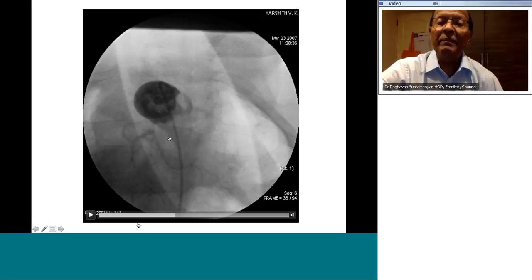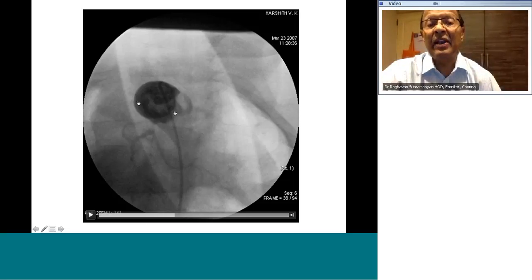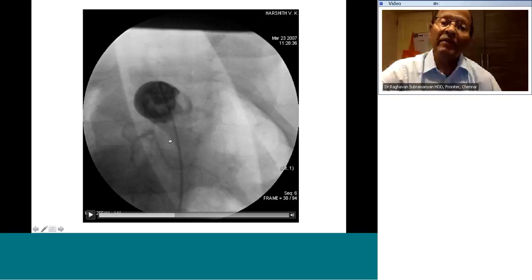Therefore, if you want to separate them and look at the aortic valve end on, this is the best view. You are looking into the aortic valve orifice, and you will be able to see the anterior and posterior sinuses, the right-sided and left-sided relationship as well as the anteroposterior relationship. Now, this view is very useful for seeing the proximal coronary artery origin in complex anomalies. I am not going into the details, but how do you identify the laid back view?